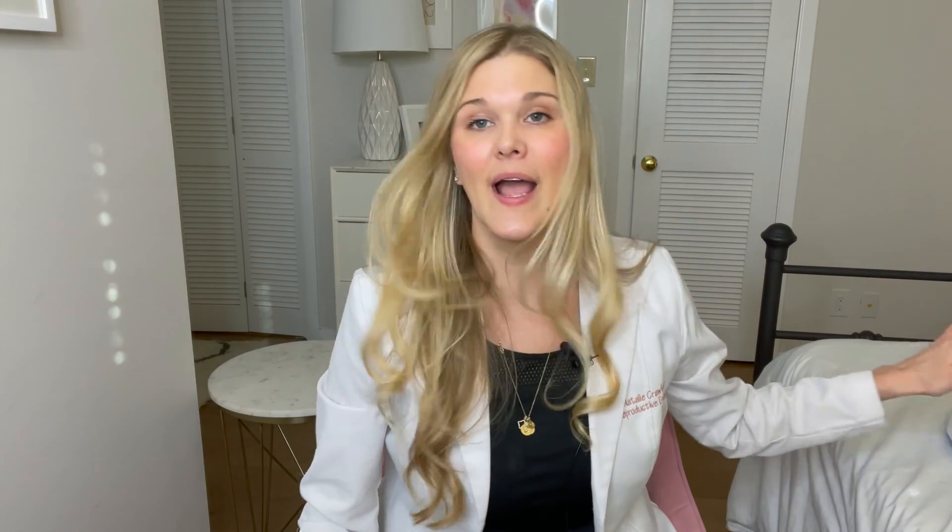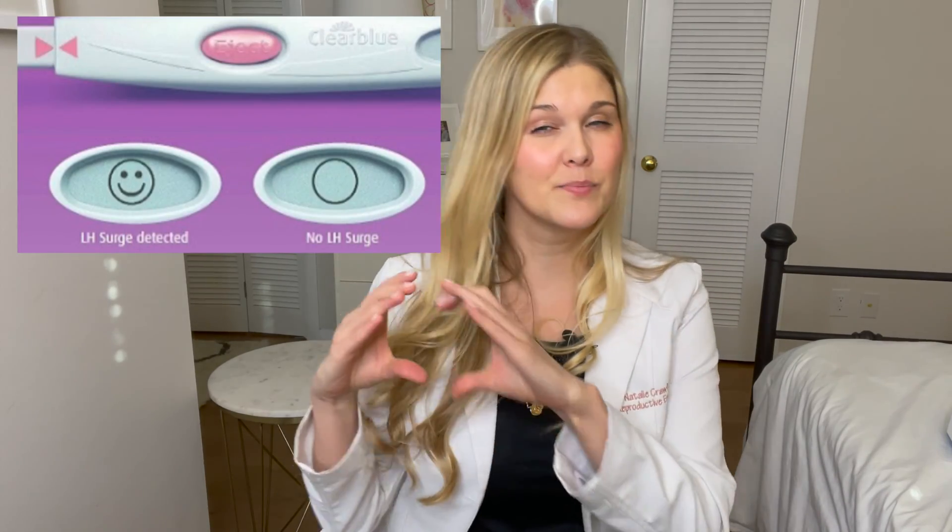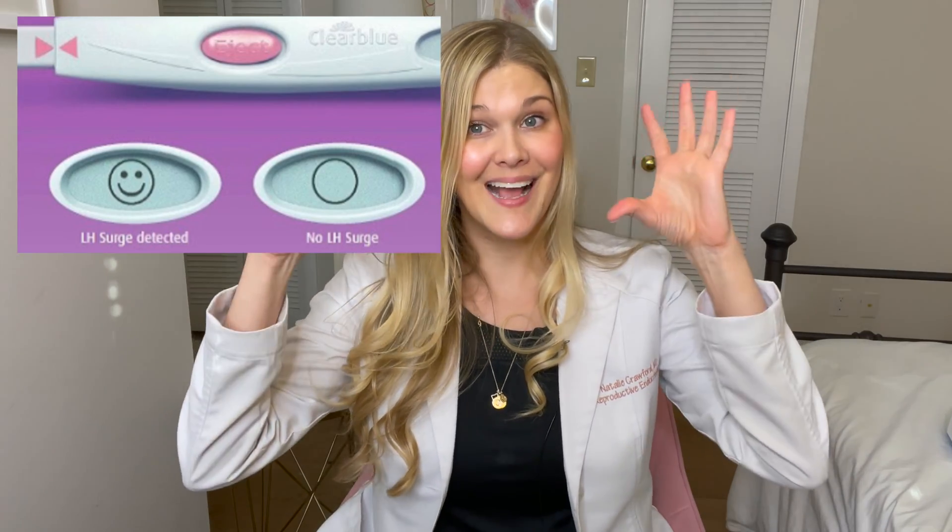There is also a digital test. The digital test has multiple different options, which is super confusing for people. One digital test tests for exactly what this line test does — if positive, it usually shows a happy face; if negative, a blank circle. So it has an LH cutoff: if you're above it, happy face; if below, nothing. That one and this line test are my favorites. Some people obsess over the line, so if you're staring at it forever, maybe just get the digital test for the two clear options.